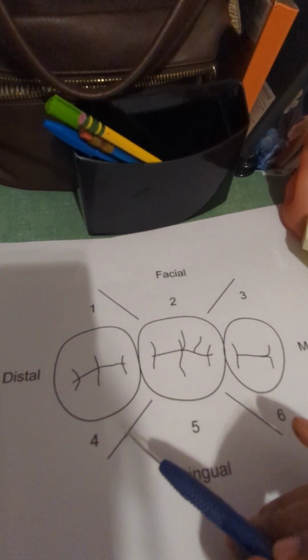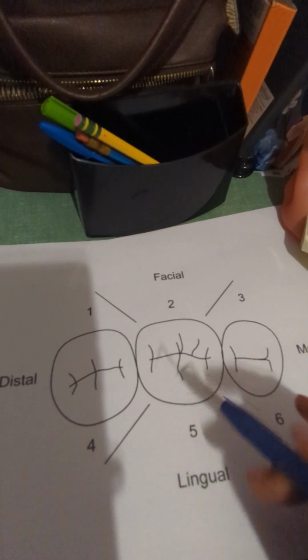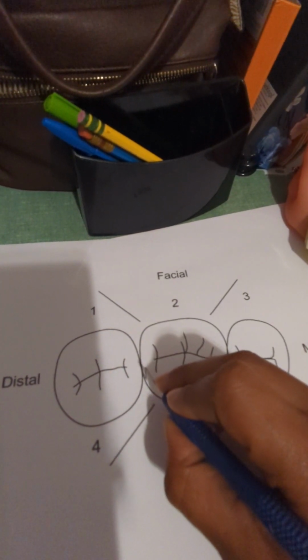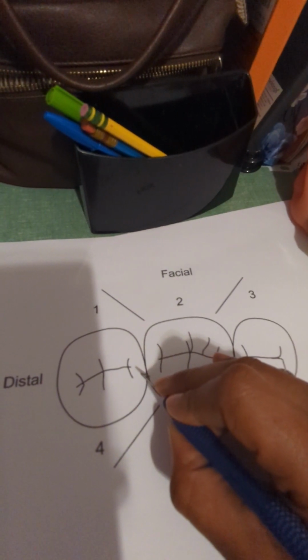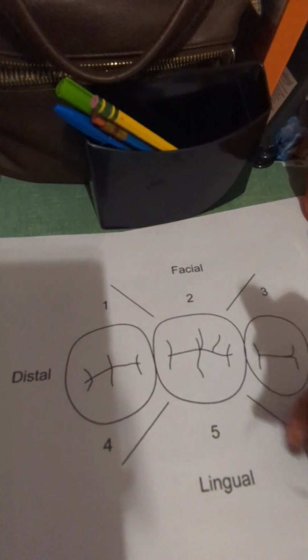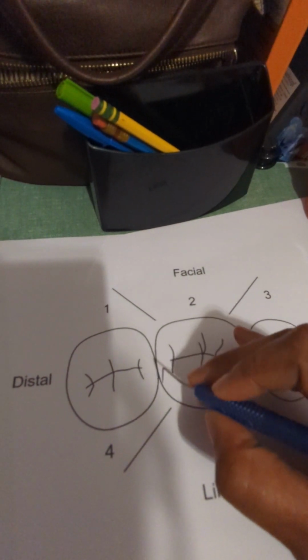You will start at the distal line angle, which is right here. You will walk your probe distally, and then you will do a slight tilt, about 15 degrees, not too much, into the sulcus. And then you will walk back.